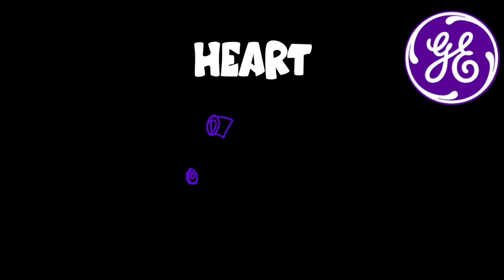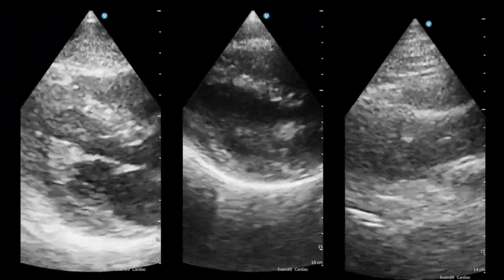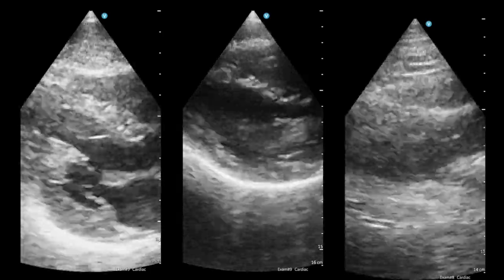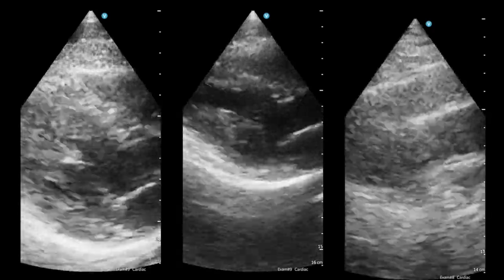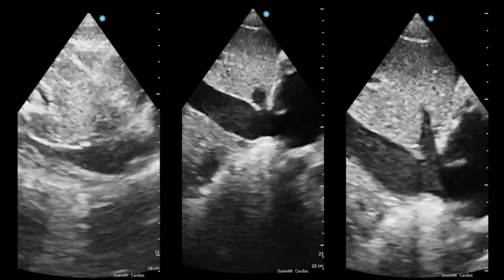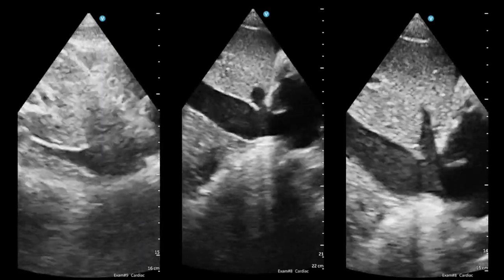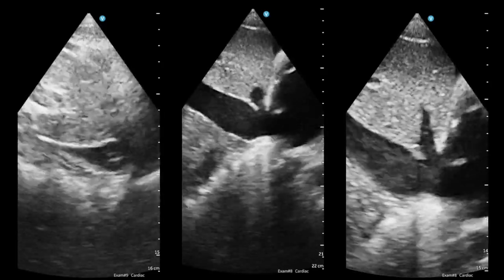So what did the images look like? We've run through some heart images using the new phased array end. These are taken from an obese patient on the intensive care unit, and you can see that the long axis views are really quite good despite the patient's larger body habitus — really impressive, clear and crisp. Here are some IVC images: a normal on the left, and then Marcus's patient with right heart failure showing a lovely plethoric-looking IVC of a good couple of centimetres plus, with some retrograde blood flow in the venous circulation.